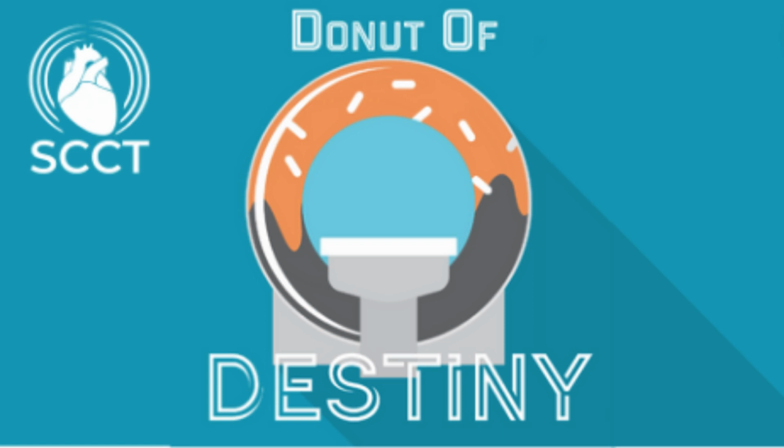Got you. For our listeners that don't do systolic imaging, could you describe the range of heart rates at which that end systolic time remains relatively static? Is it up until a certain heart rate threshold, 100 or so? Yes. I don't think there is any credible data to back that up, but I'll speak from my experience with current generation dual source scanners, like Force.